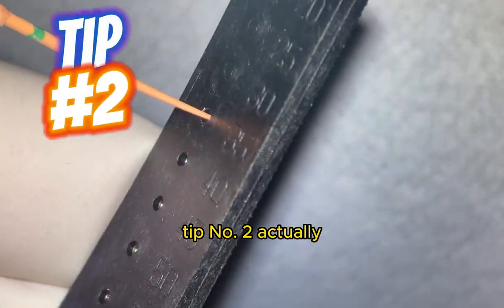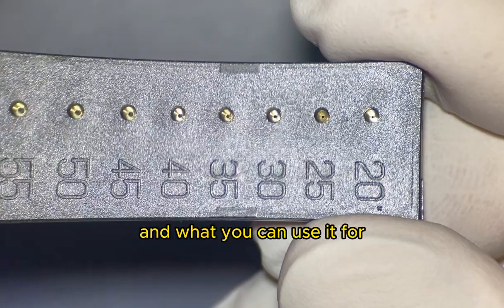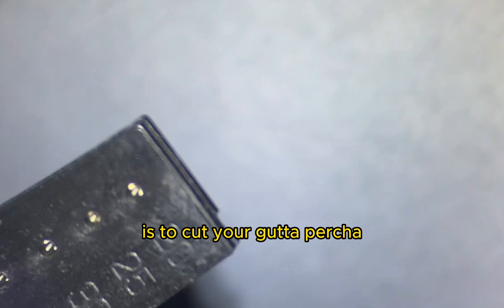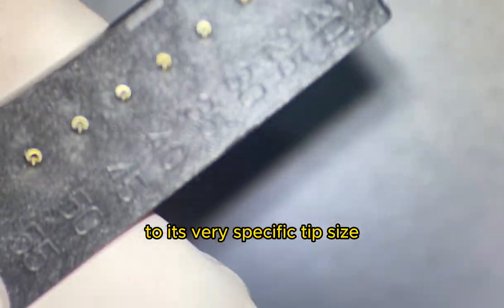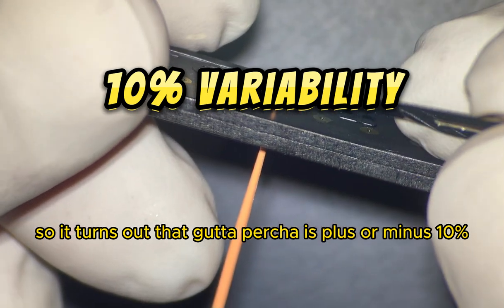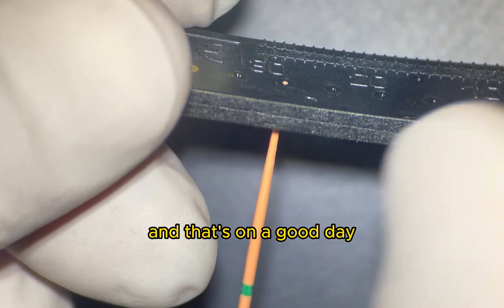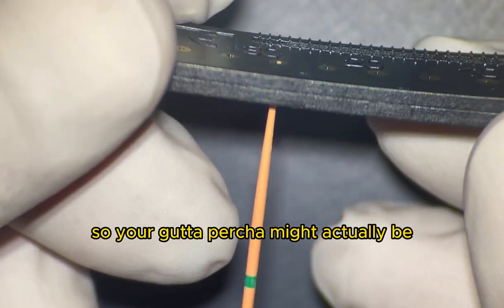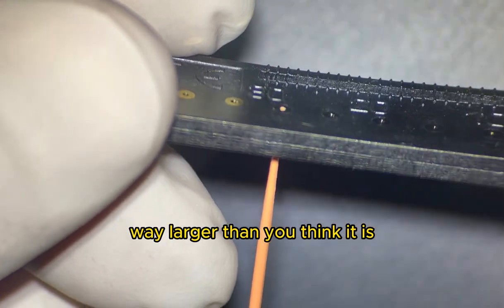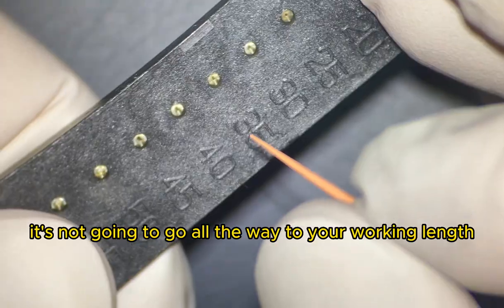Tip number two might be something you don't even know is going on. This is a gutta gauge, and you can use it to cut your gutta-percha to its very specific tip size. It turns out that gutta-percha is plus or minus 10% — big or small — and that's on a good day. So your gutta-percha might actually be way larger than you think, meaning it won't go all the way to your working length.